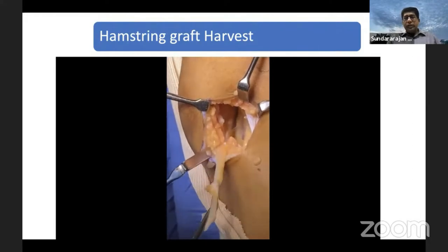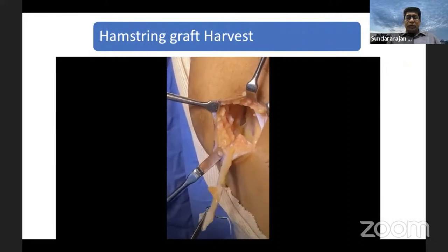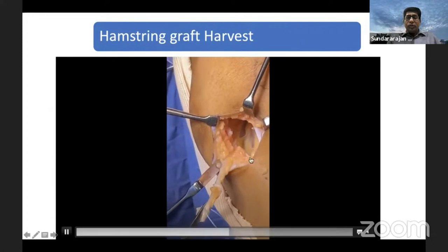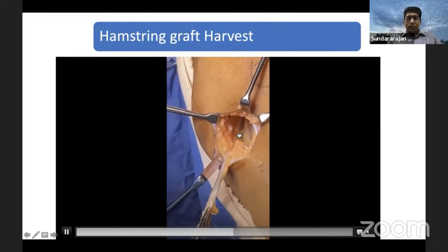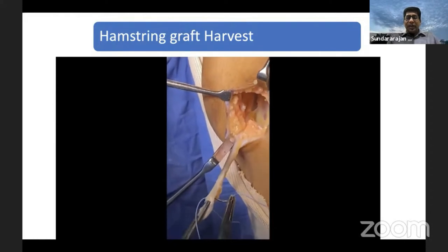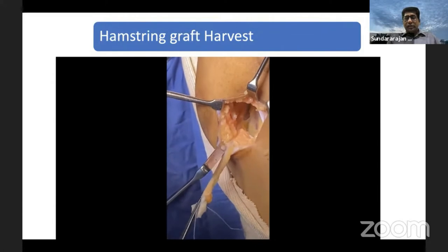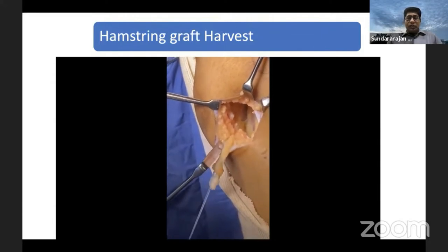It is very easy. The only problem is if you don't release enough vinculi, then there is the possibility it can get cut. Once you see around 8 to 10 centimeters exposed, most probably you are safe. But you have to spend some time to release the vinculi when taking the semitendinosus graft. Gracilis doesn't have much attachment, but semitendinosus has got at least three vinculi, and those have to be released with your scissors very carefully.